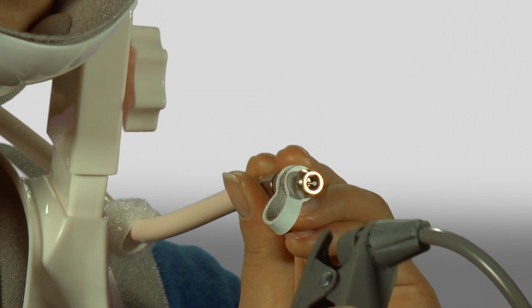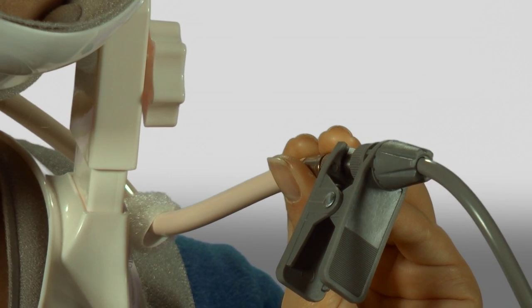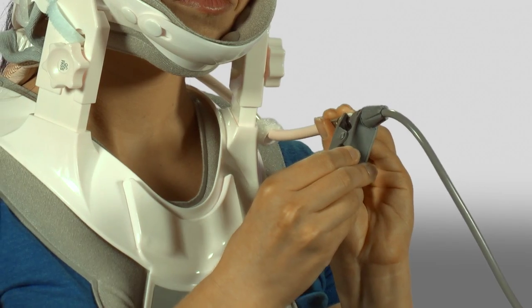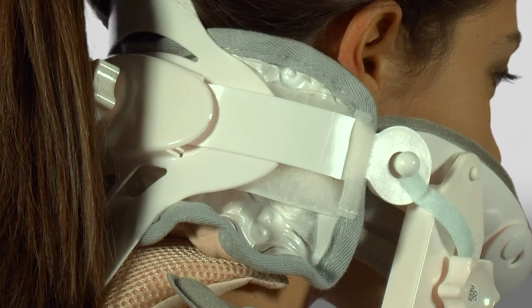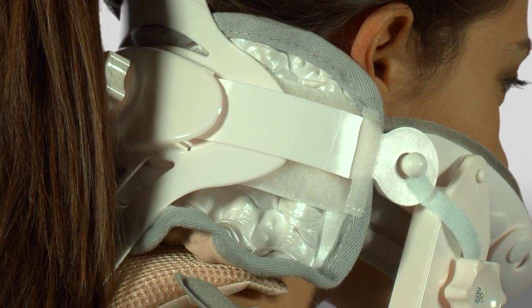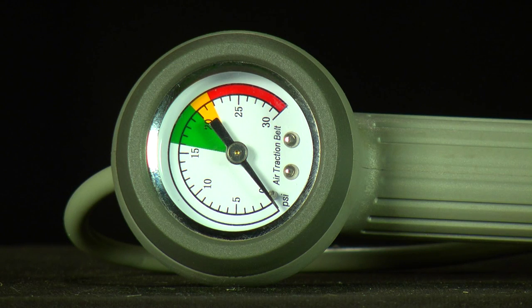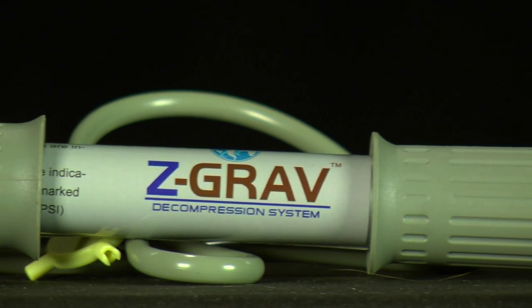Take the hand pump provided with your device and attach the pump clip to the silver valve. You should practice this prior to application to better visualize the process. Slowly move the pump handle in and out to inflate the BodyJack air columns. Inflate to your desired comfort level. The hand pump dial is to remind the user when inflation is complete and the columns are fully expanded. Inflating beyond the recommended pressure is limited by a governor on the hand pump.